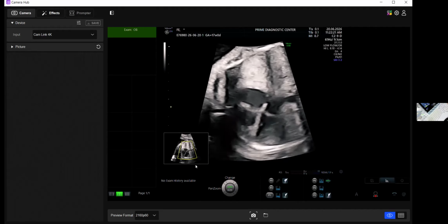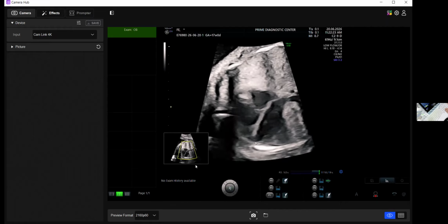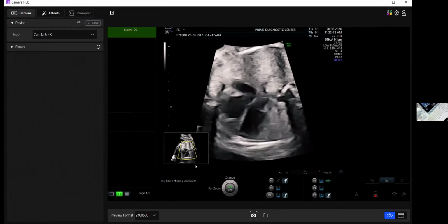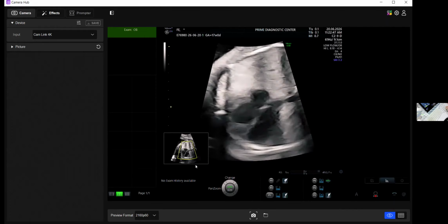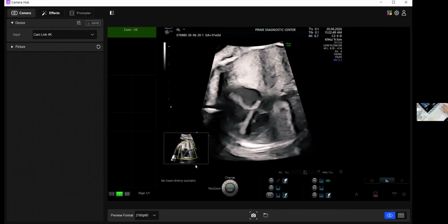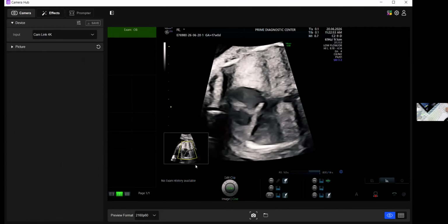I can answer that by doing Z-scores here, but with experience, I know once the LV is forming the apex, that means the LV is not small. When the LV is small, the first portion that goes is the apex, it doesn't form the apex. So if the LV forms the apex, that means the RV is large. All right, so that is rule number one. The LV is forming the apex, and that means the RV is large, and we need to find out the reason why.